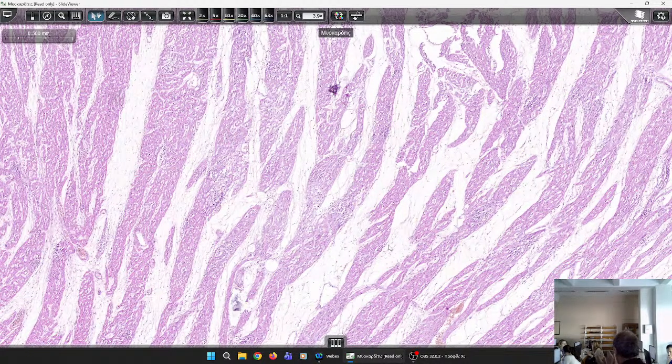And we have this increase in the distance of the damaged myocytes. Yes, I would say due to the increase of the pressure. However, this is due to an exudate formation here. So, what is that? Is it the inflammatory exudate? The inflammatory exudate, however, here we see it as edema. This is edema.